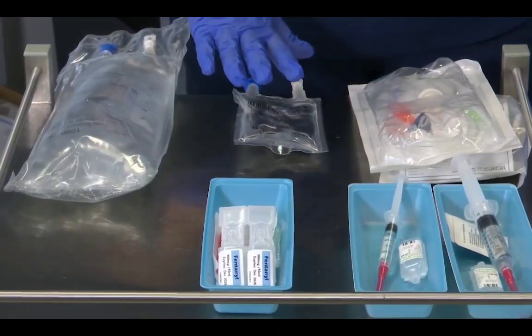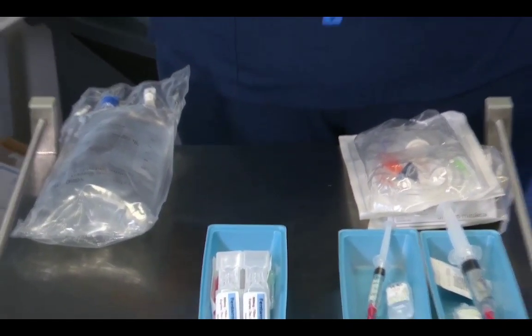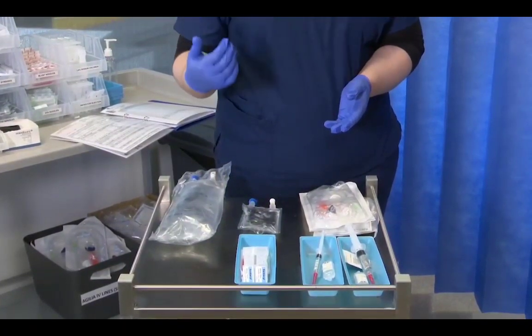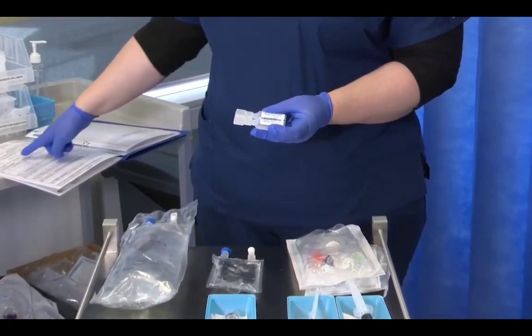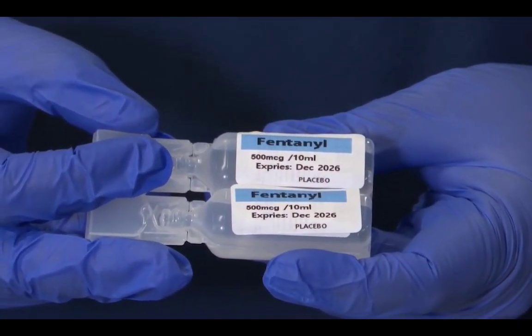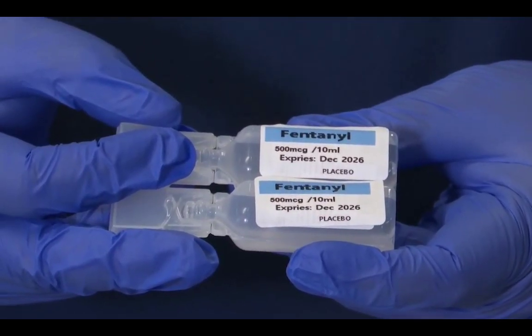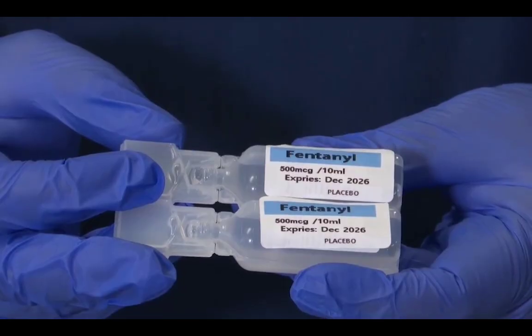So now that we have removed the 20 mils from the sodium chloride bag, we have 80 mils in here. As we said earlier when we were pulling the medication out of the cupboard, we know that our fentanyl, we have an order for 1,000 mics. Our ward stocks fentanyl 500 mics in 10 mils. That meant that we required 2 10 mils, which was 20 mils. So as we know, the fentanyl had to come out of the cupboard with 2 RNs.